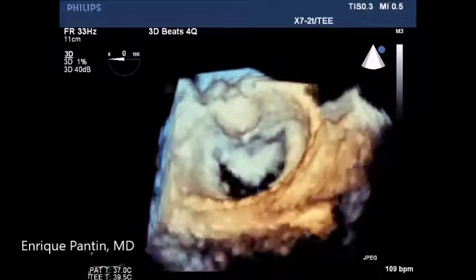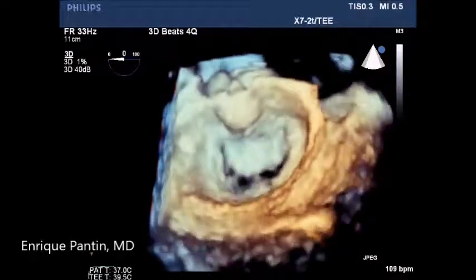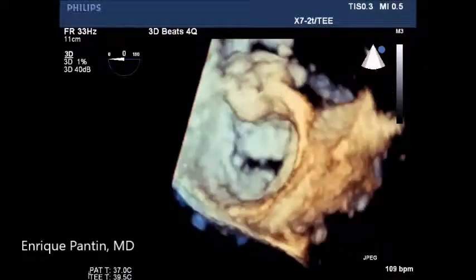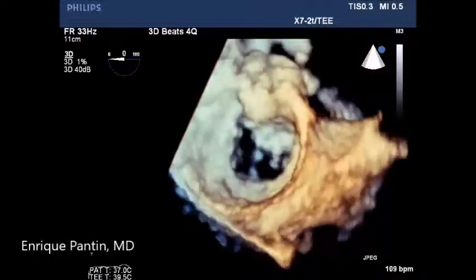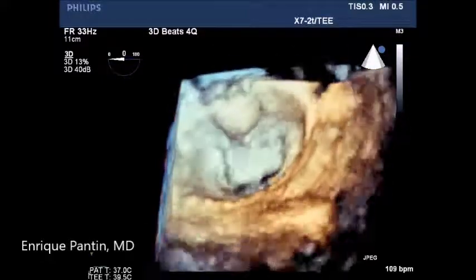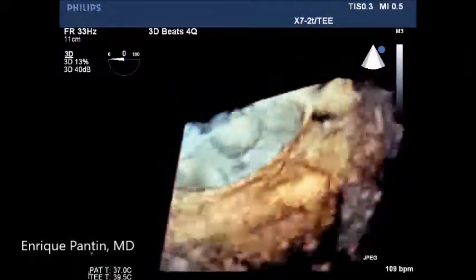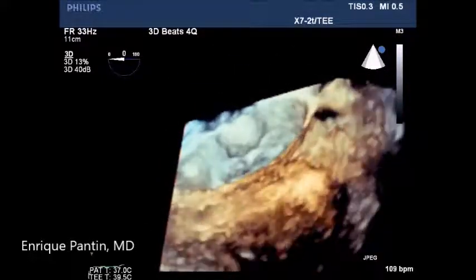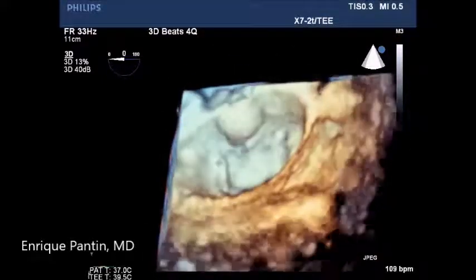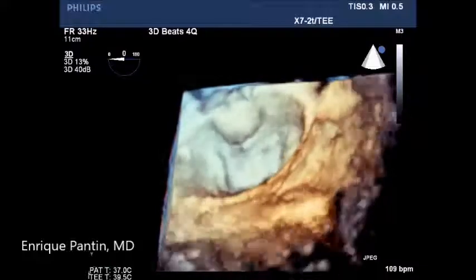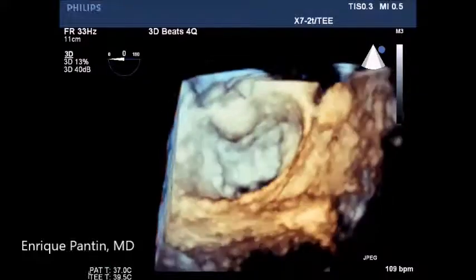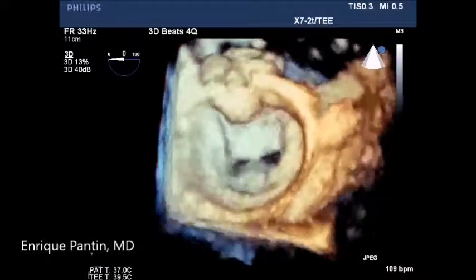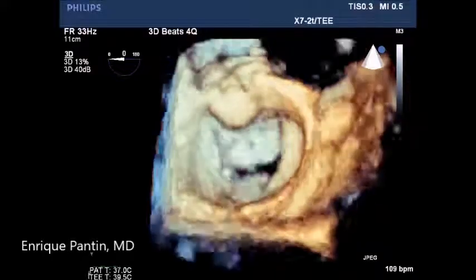Sometimes this is difficult to see on 2D imaging for sure. With attention, it can be found quite often in the imaging. There are multiple changes in the angle view of the coronary sinus just to follow the anatomy better.